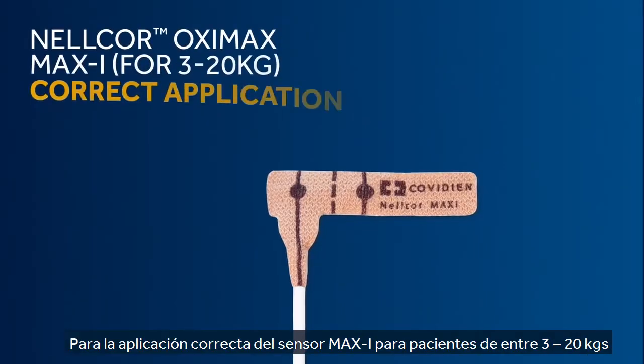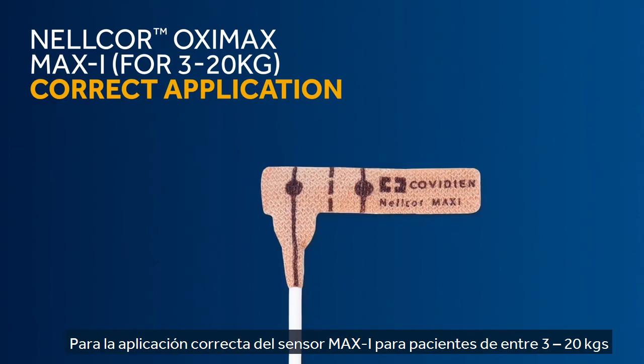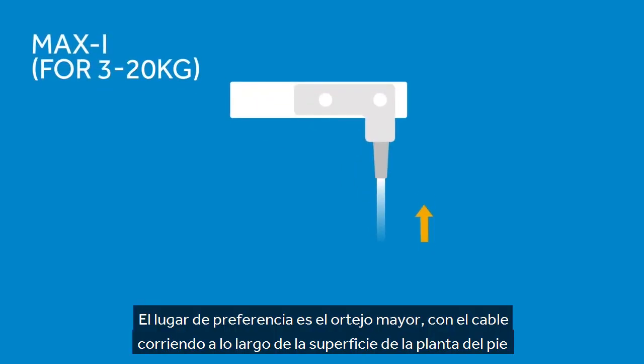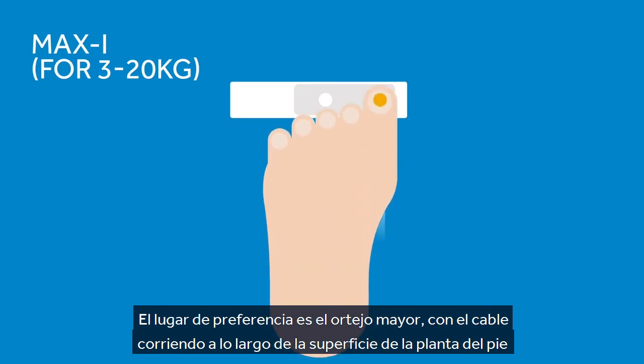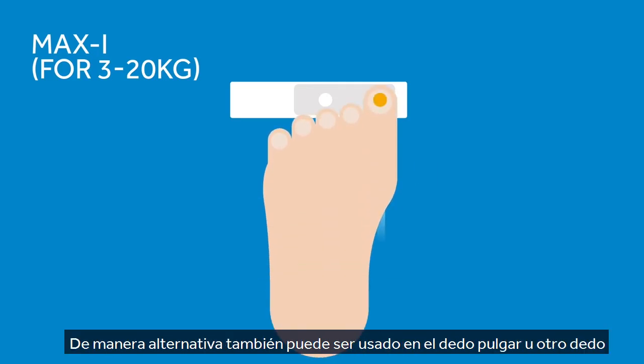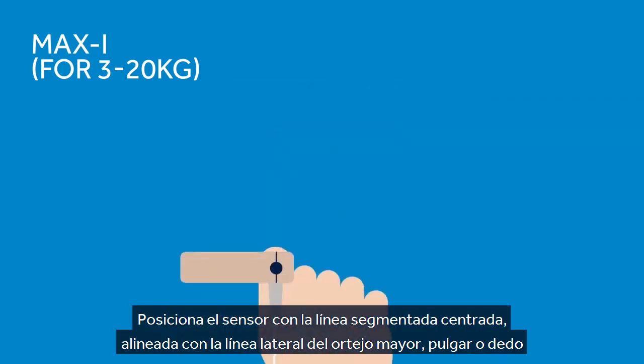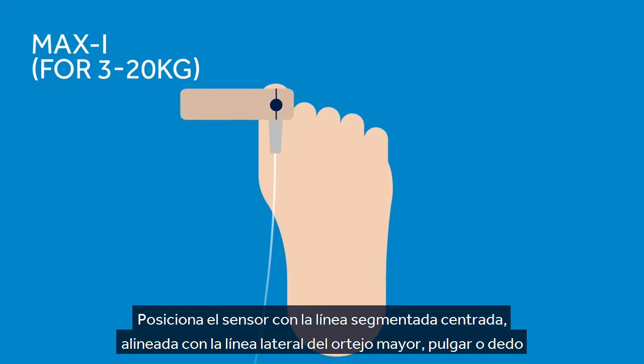To correctly apply the Max-I for 3 to 20 kg patients, select a sensor site. The preferred site is the big toe, with the cable running along the sole of the foot. Alternatively, apply the sensor to a thumb or other finger. Position the sensor so the dashed line is centered on the lateral edge of the big toe, thumb or finger.